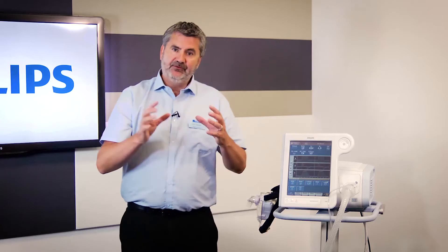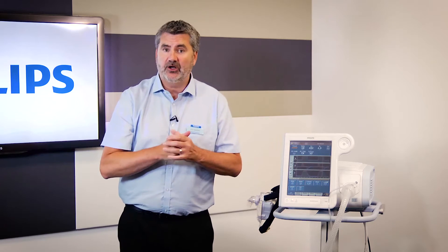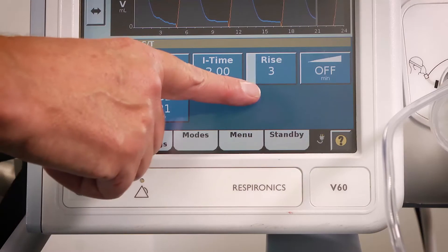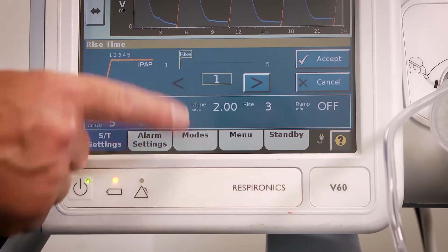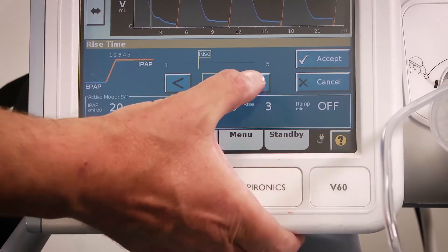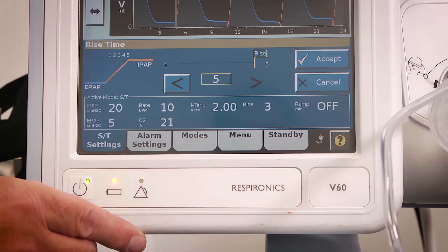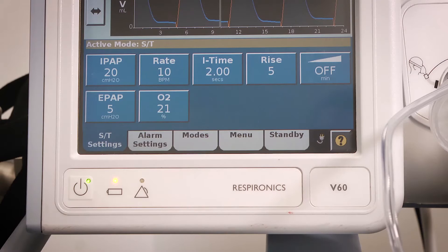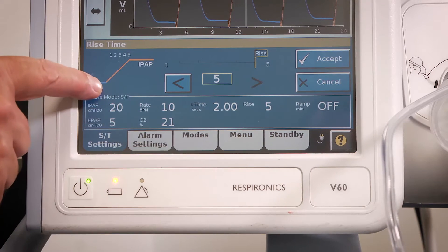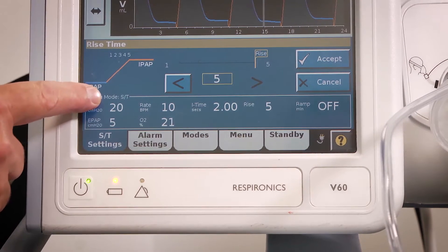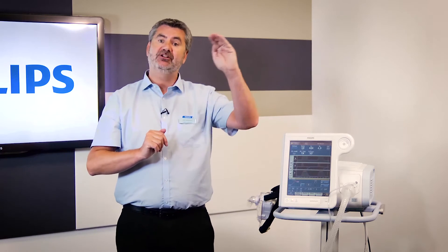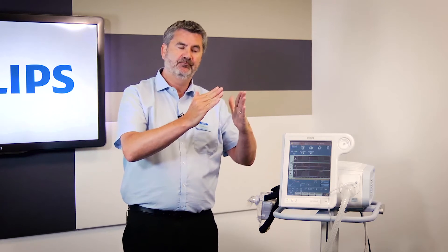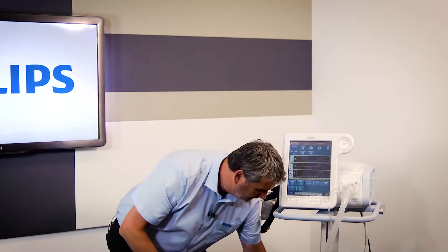Rise time is very important and is very much a nursing and physio role to monitor with every observation. You can choose numbers 1 to 5 — think of these as 0.1, 0.2, 0.3, up to 0.5 of a second. This is the time it takes for the machine to detect the patient breathing in and then achieve the target IPAP. On setting 1, it reaches IPAP within 0.1 of a second; on setting 5, it's much more gradual.